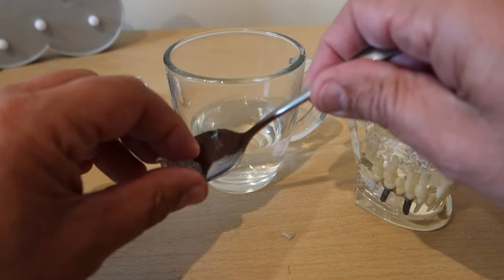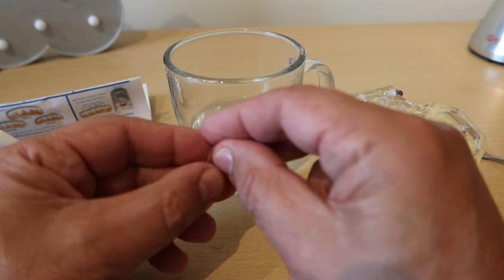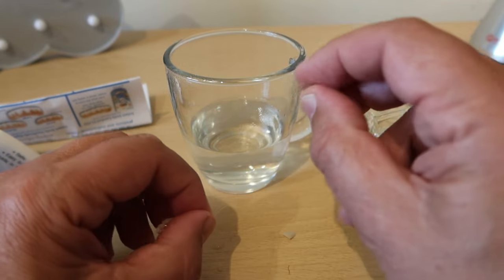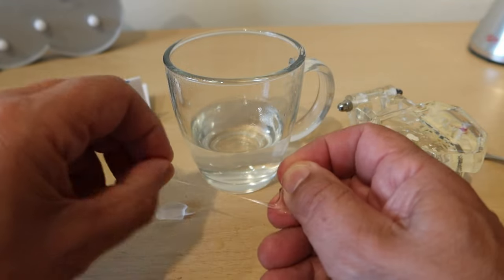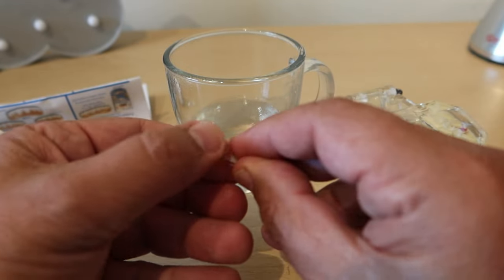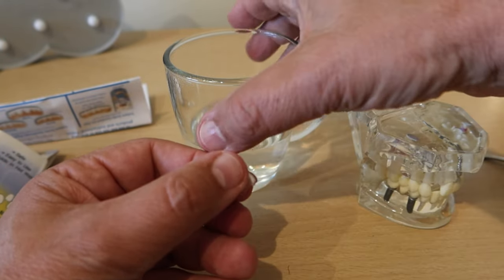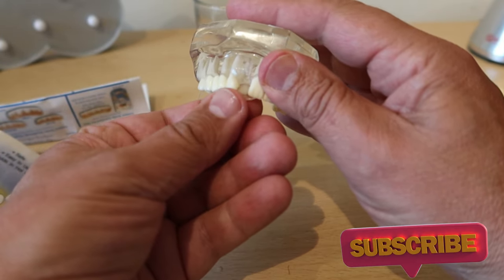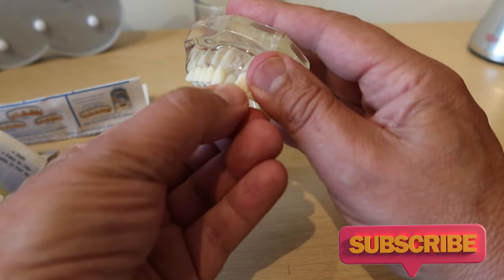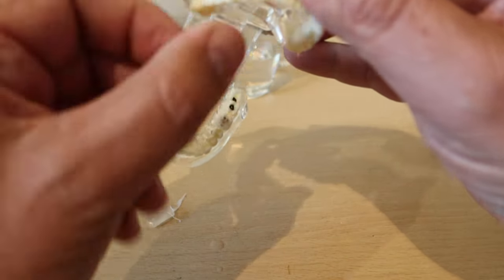Now fairly rapidly tear yourself off a little bit of this material — it's a bit like chewing gum really — and you can stick that to the back of the tooth that we selected earlier. Then you can put that into position in your mouth, or in my case on my friend here, and squidge it around so it fits. You want plenty on the back to keep it in place.